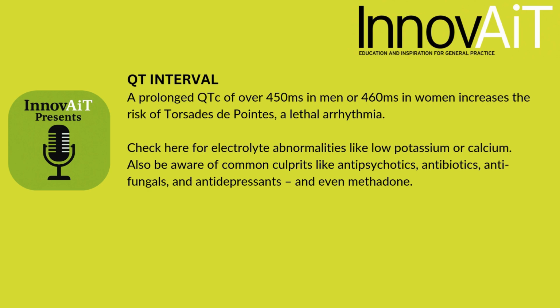Check here for electrolyte abnormalities like low potassium or calcium. Also, be aware of common culprits like antipsychotics, antibiotics, antifungals, and antidepressants, and yes, even methadone.